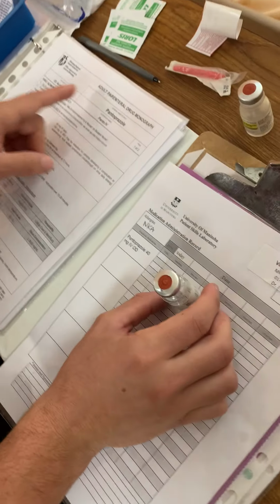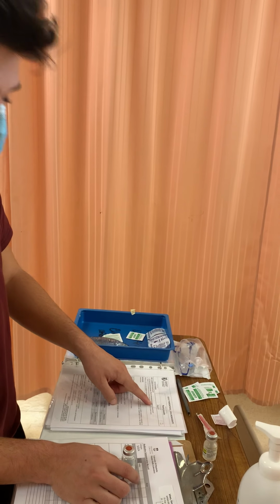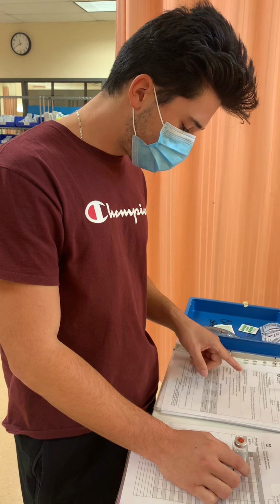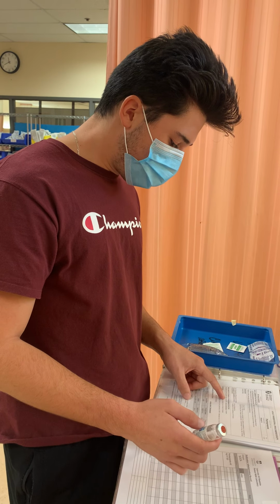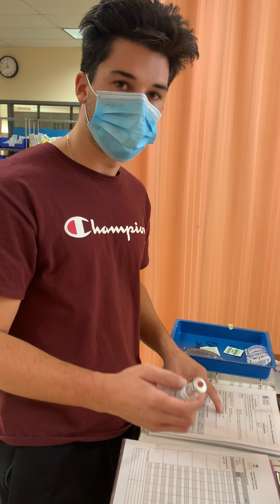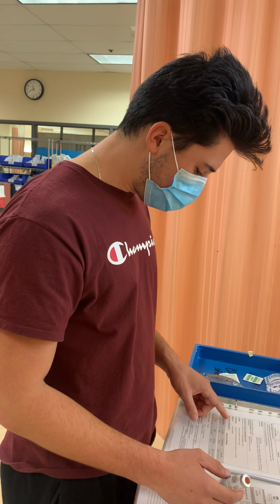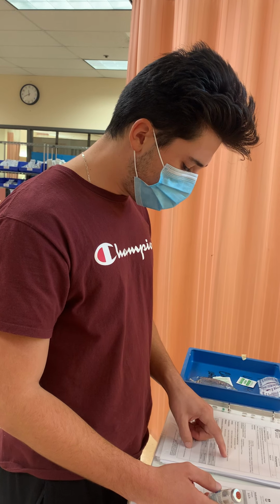For Pantoprazole, it is a GI acid inhibitor, which is why they're taking it, as they have their peptic ulcer. It can be given by a nurse or a student nurse, so I'm safe to give it. The usual dose is 40 milligrams, supplied as a 40 milligram vial, and I am to add 10 milliliters of normal saline for a final concentration of 4 milligrams per milliliter. Then I'm going to dilute it into 50 or 100 mLs of normal saline and administer it over 15 to 30 minutes.